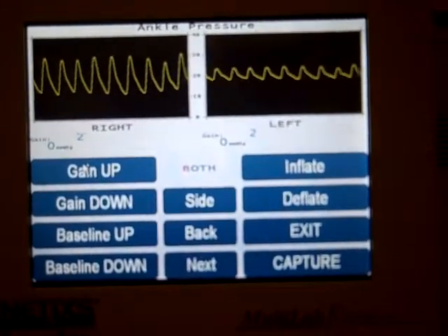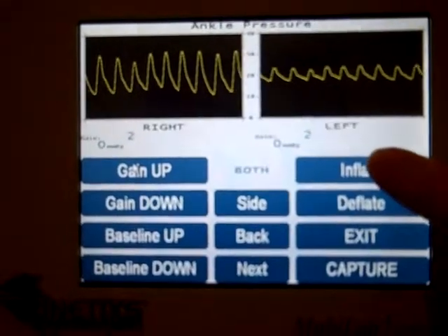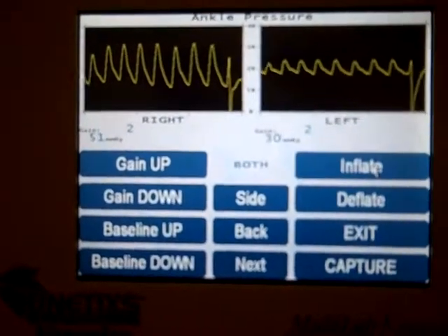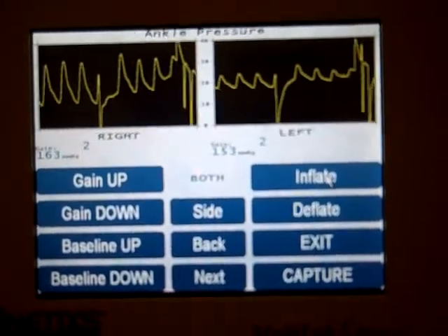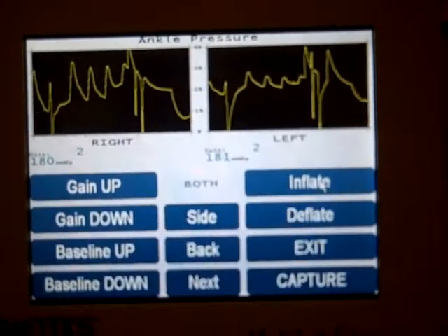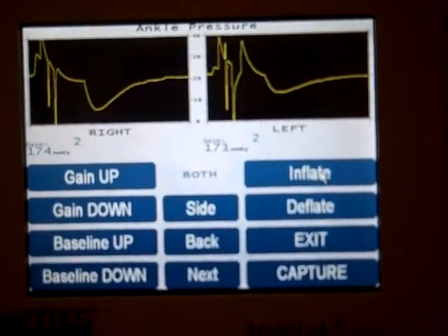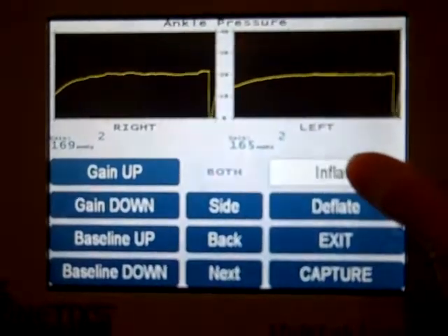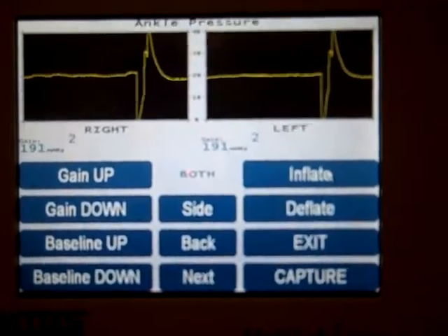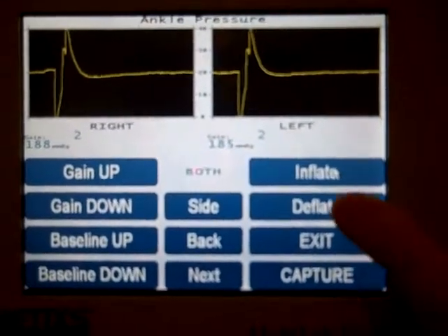Once you've got waveforms scrolling across on either side, simply press the inflate button and wait until you see a flat line. Sometimes the pump will shut off but you'll still notice that your waveforms are pulsatile. You can see some small pulses right there, so go up a little bit higher until you're sure you've got a flat line before you press deflate.